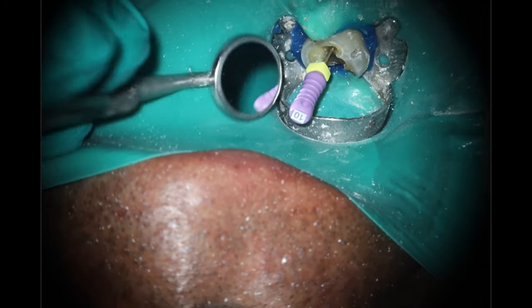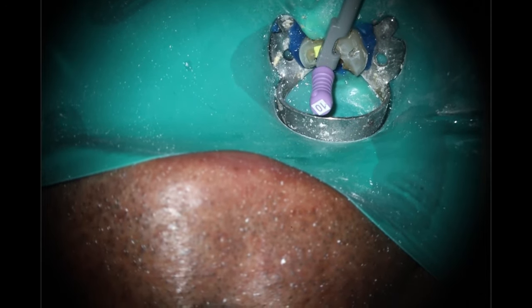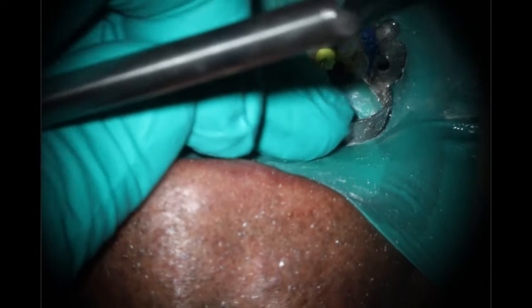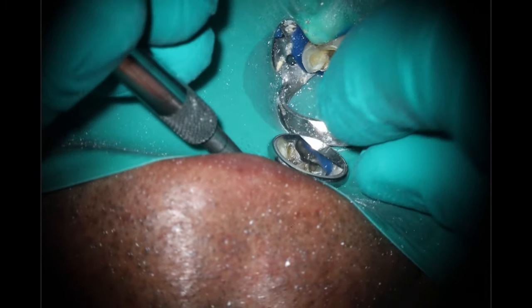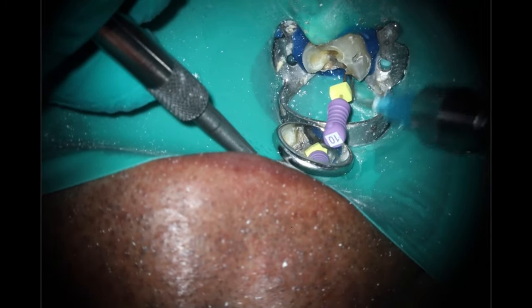I kept the whole working length in this one because I was able to keep the video relatively short — that 20-minute mark seemed ideal. Treatment time on this case was probably 25 minutes from start to finish, not including anesthesia. Working down to the bottom just like we normally do — going all the way down to the zero-zero point, which is what I like to shape to. There are pretty good studies showing that half-back is not accurate regardless of what companies tell you. Now trying to get into these distals — there's a little bit of block-out in my way, which is why the reading is so short.